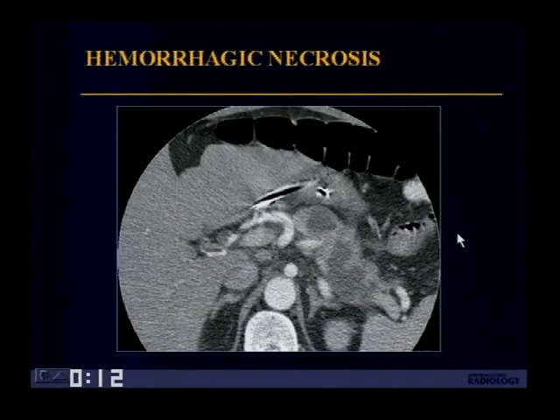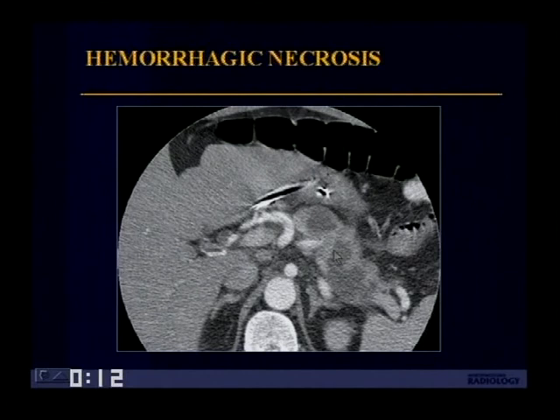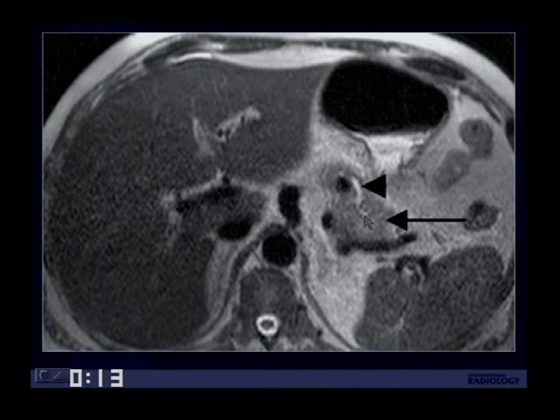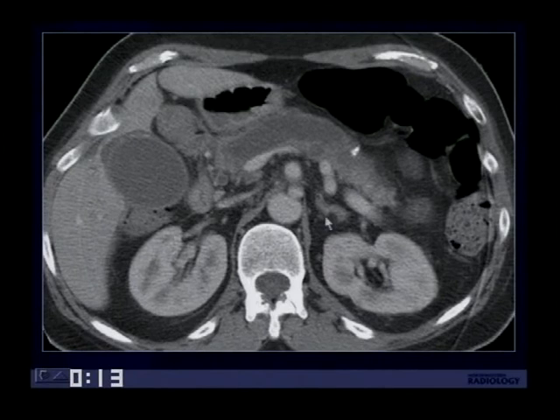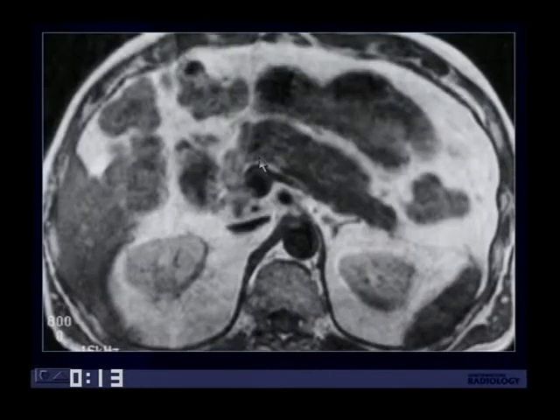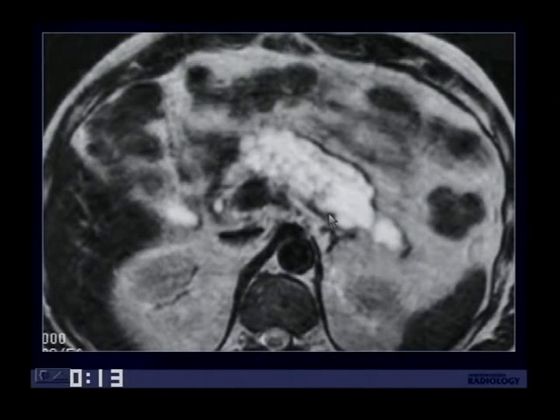Here's a patient who presented with abdominal pain with a CT showing low density in the pancreas — it's difficult to tell if this is necrosis, a dilated duct, a pseudocyst, or an intraductal papillary mucinous tumor. MR examination shows it is not a dilated duct or pseudocyst — you can see the normal-appearing pancreatic duct — and similar to the CT, you see lack of enhancement of a large portion of the pancreas with areas of increased signal intensity, due to hemorrhagic pancreatic necrosis. Another patient with abdominal pain but not very sick had a low-density area replacing the pancreas; on MR T2-weighted imaging, bright signal with locules of dilated ducts suggested an intraductal papillary mucinous tumor, confirmed on ERCP with mucin pouring out of the duct.